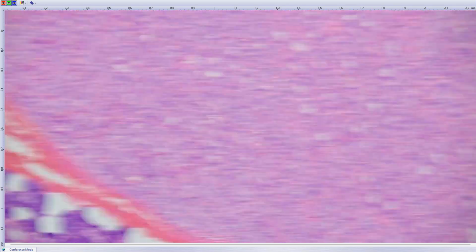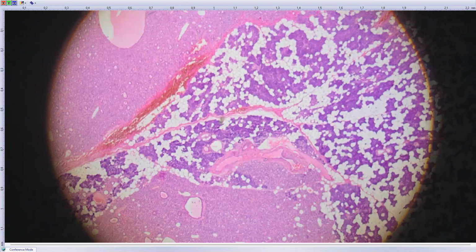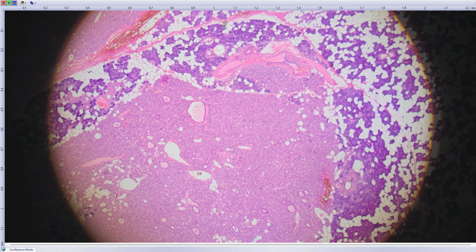And it's a nice case because it is possible to see also these hyperplastic nodules. So if you have multiple foci, maybe hyperplasia, but the dominant nodule is adenoma. So striated duct adenoma with IDH mutation, yes, there is a mutation of this gene.